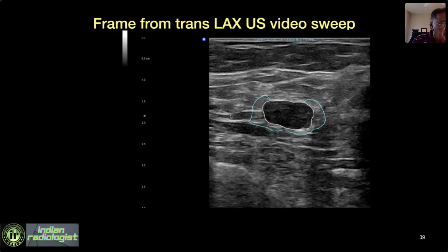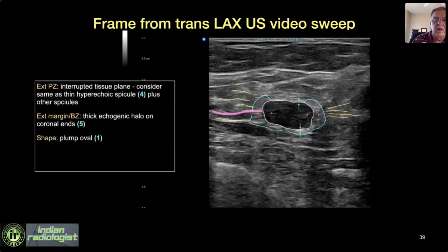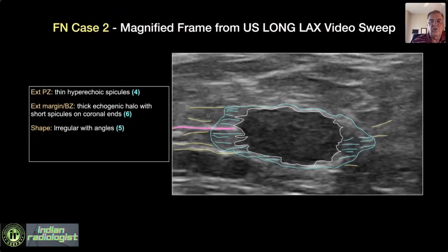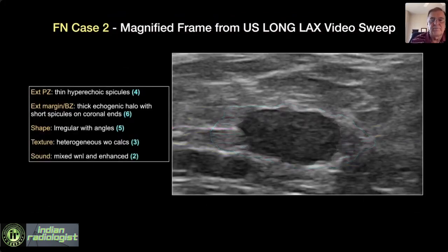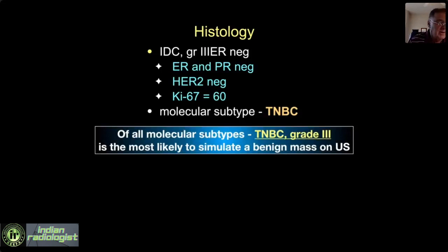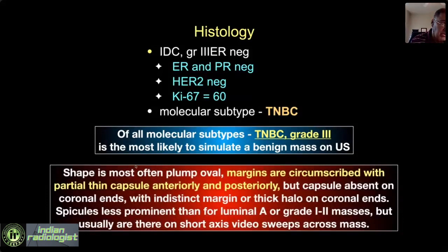The best way to see these spicules is a short axis video sweep — you can see hyperechoic spicules pulling in and going out as you sweep back and forth across the lesion; it's much more apparent than on any still image. The yellow lines show the hyperechoic spiculations. This was a grade 3, ER/PR-negative, HER2-negative, triple negative cancer with KI67 of 60%. The two still images originally looked falsely reassuring, but storing video loops and carefully looking at the frames allowed correct classification as BIRADS-5.